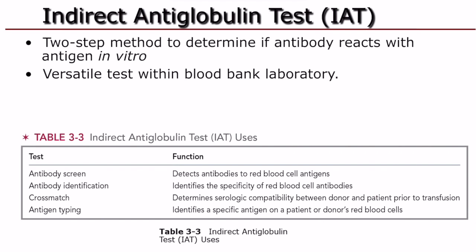Our indirect antiglobulin test, which you're going to do next week. We'll do it in lab. It is a two-step method, and this is where we have our tube.